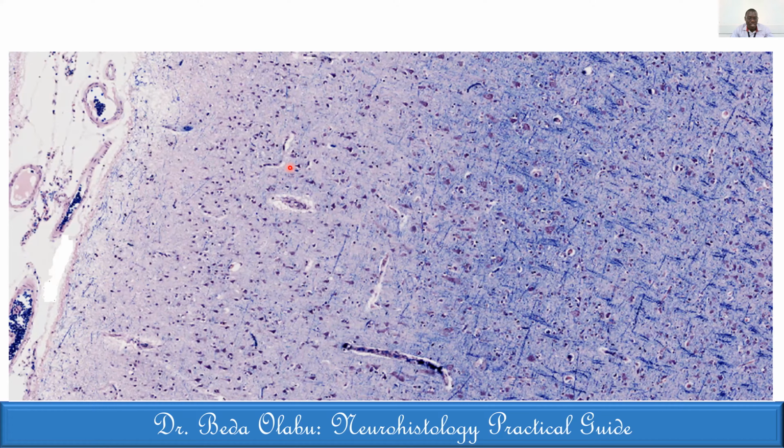As she's mentioned, we can see cells transitioning. You cannot see a distinct junction of transition. You can't say it is here, at this point. We don't have sharp transitions, but we have progressive transition. The transition we're talking about here is regarding the cellularity, but that may not be very distinct, but also regarding the shape of the cells.